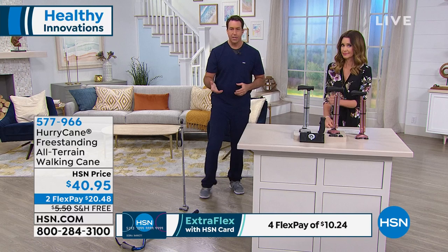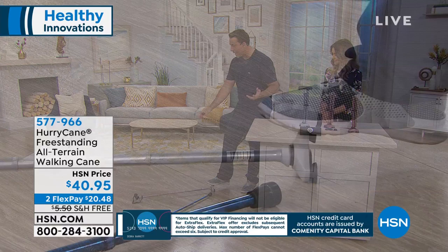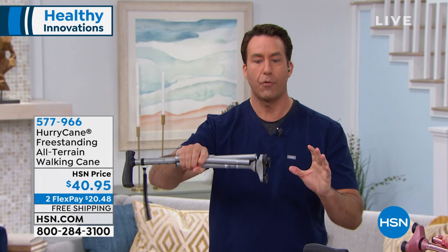I can't guarantee you'll never drop your Hurricane, but with a little bit of practice you can just use your foot and pick your Hurricane right back up in your hand. The point is your Hurricane gives you that ultimate freedom, ultimate independence. To fold it back up, I simply have to pull it in two places and it's folded all over again.